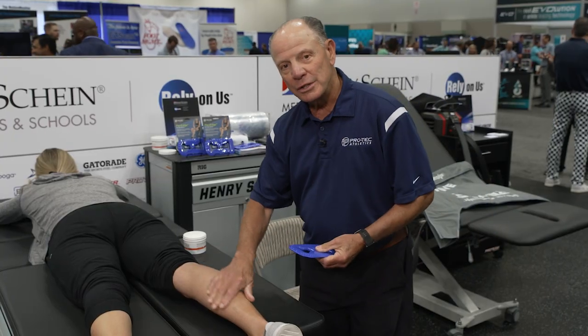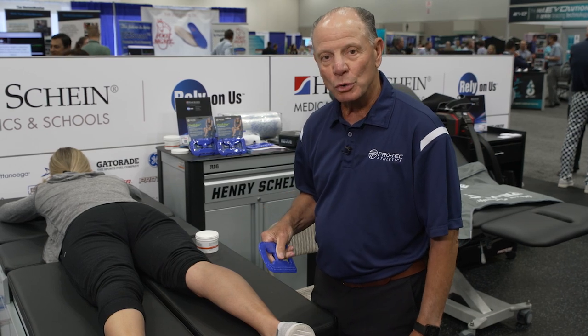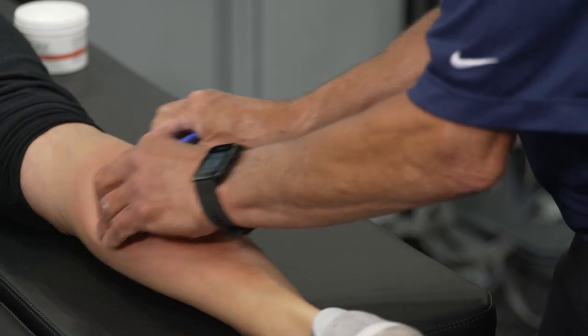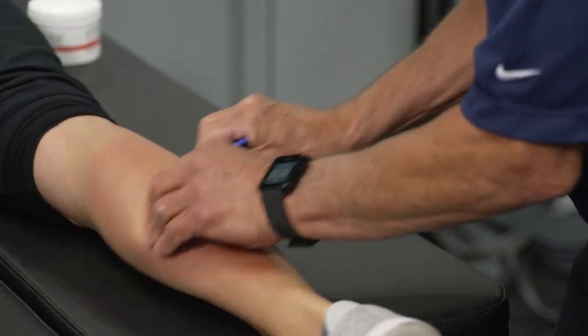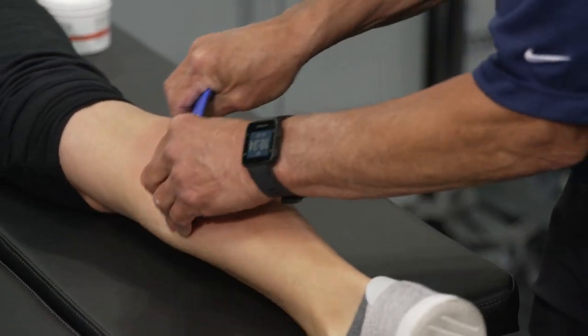If I want to use this on the calf and I want to do what we call a pin and release, which is sort of a myofascial technique, I can lay it on the tissue. I can mold it to the calf and I can take it and move the tissue, stretching it laterally in all directions.